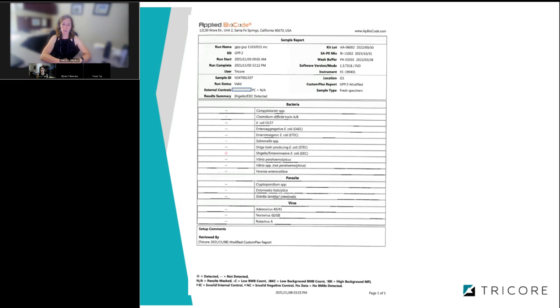They also could be at a level that's just too low to detect by culture. So there are some caveats to considering those true negatives. It was an option that we had available, and so we used it in order to look at those discordances. But it wasn't perfect in any way.